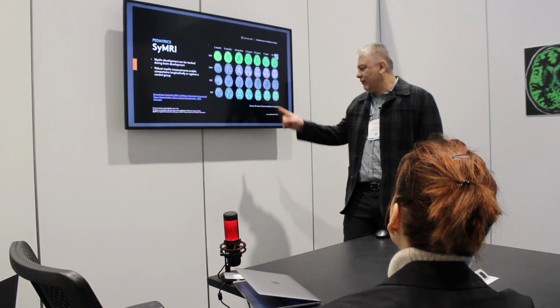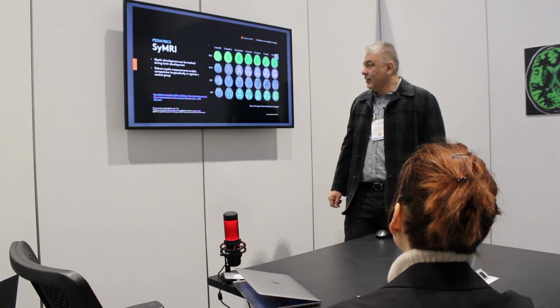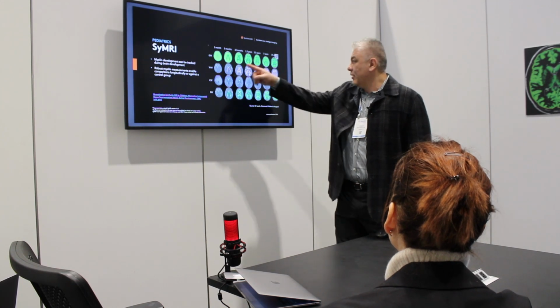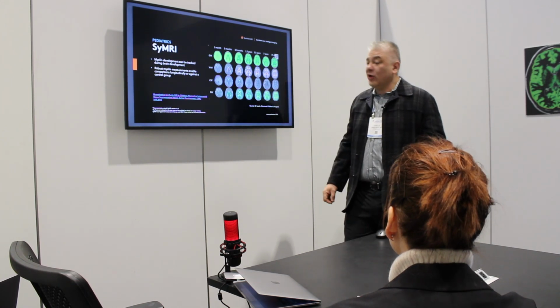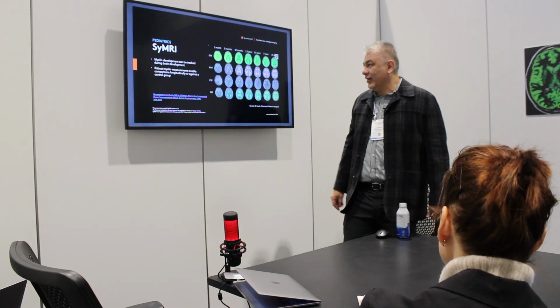And a really nice article from Cincinnati Children's. So I have a case. This is normal, yeah, for age. But I'm going to show a case of mine that is actually abnormal. So I'll show you in a bit.